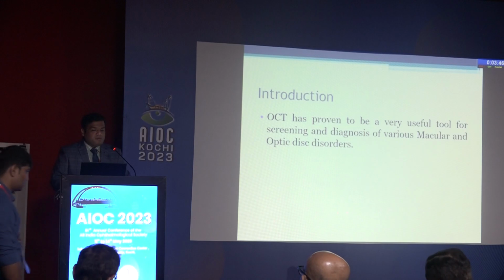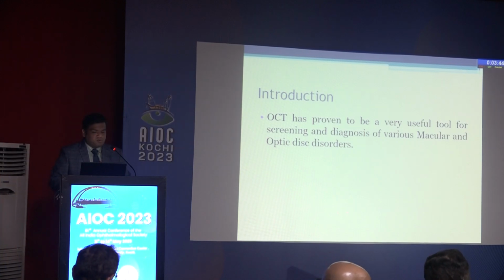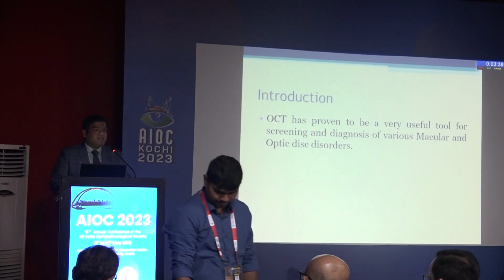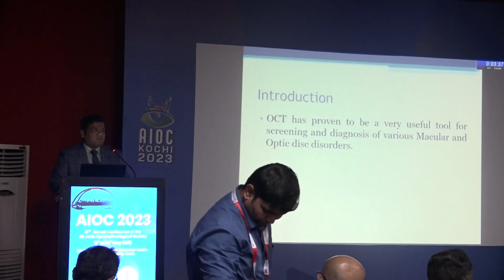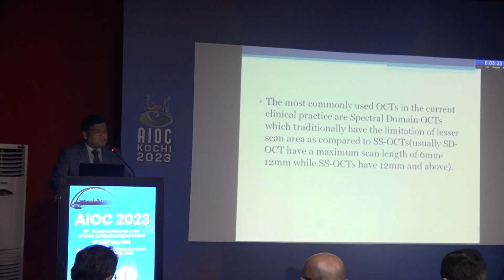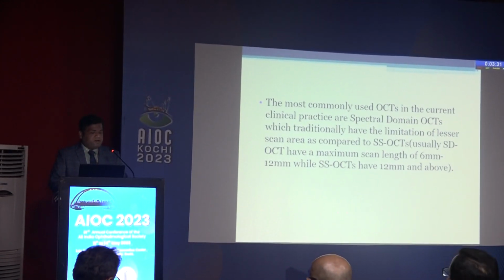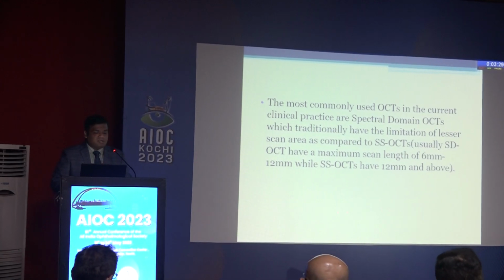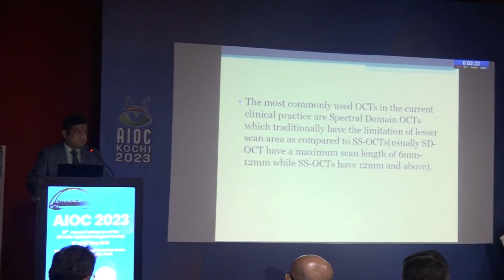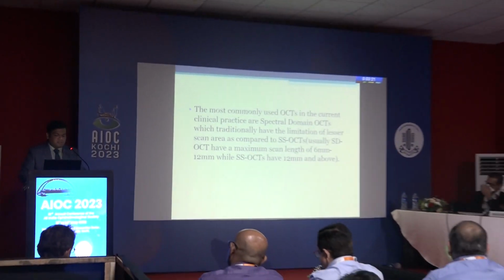OCT has proven to be a very useful tool for screening and diagnosis of various macular and optic disc disorders. We all use OCT routinely in our OPD setups for diagnosing pre-cataract patients, for ARMD, for DME, etc. The most commonly used OCTs in current clinical practice are spectral domain OCTs, which traditionally have a limitation of lesser scan area as compared to newer generation OCTs of swept source or newer generation spectral domain OCTs.